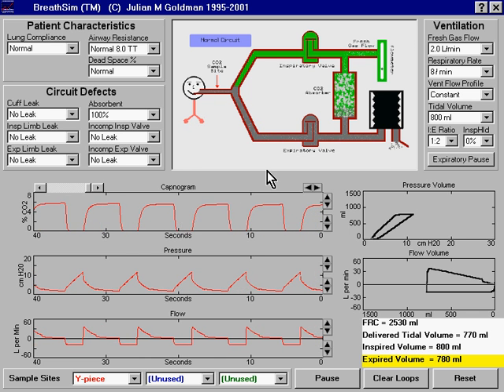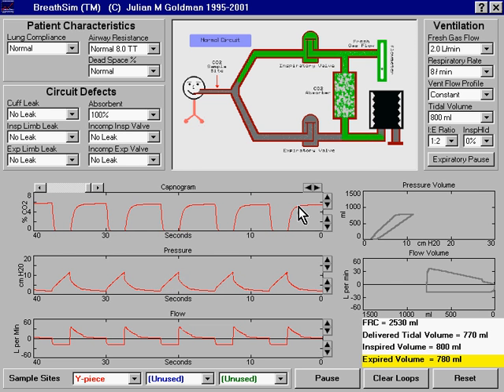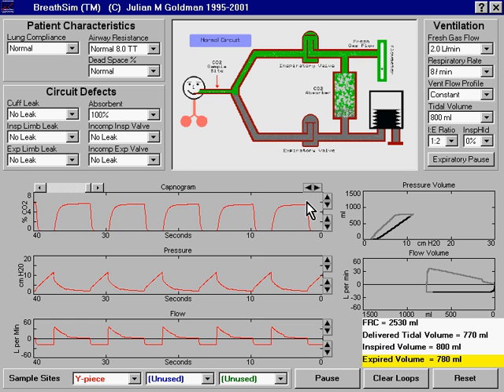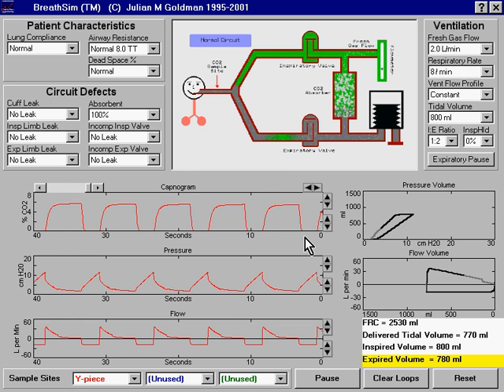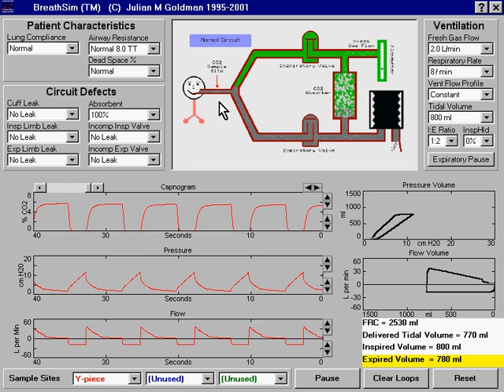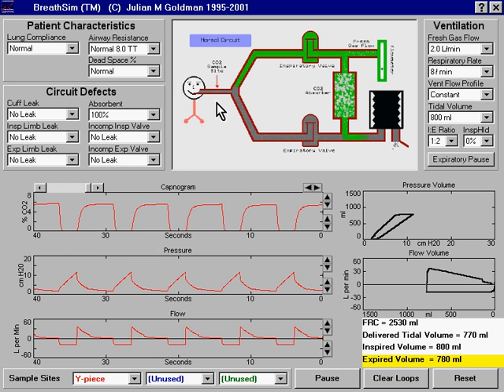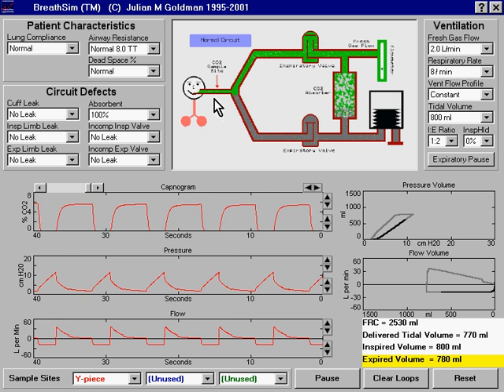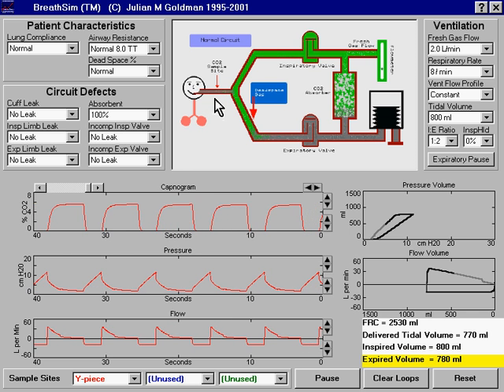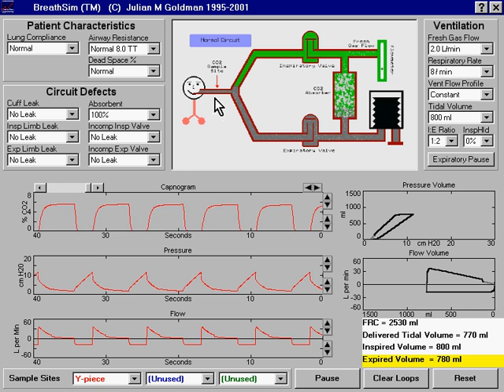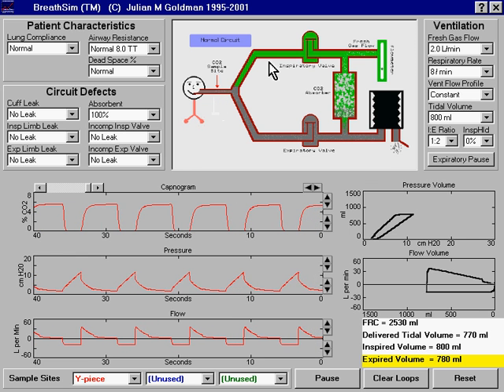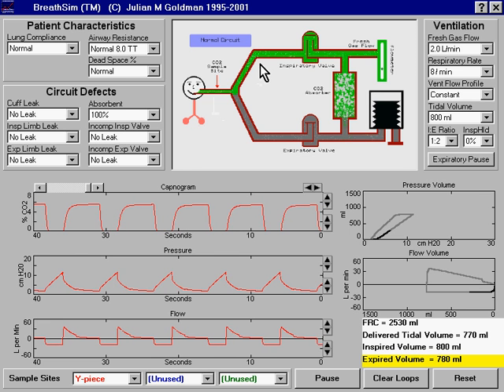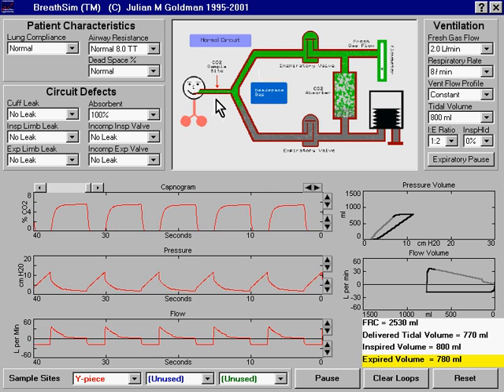Normally, a capnogram rises rapidly at the beginning of expiration and falls rapidly at the beginning of inspiration. The rapid decrease in CO2 concentration at the beginning of inspiration occurs because the CO2 that was previously exhaled and sits at the sample site is washed rapidly back into the patient. This rapid wash-in occurs because the inspiratory limb is full of fresh gas, and that fresh gas during inspiration rapidly washes the CO2 away from the sample site.